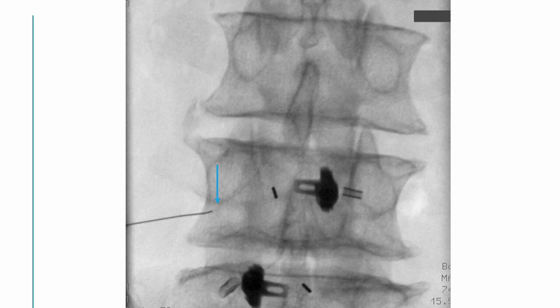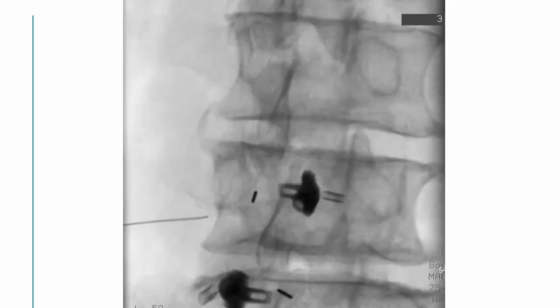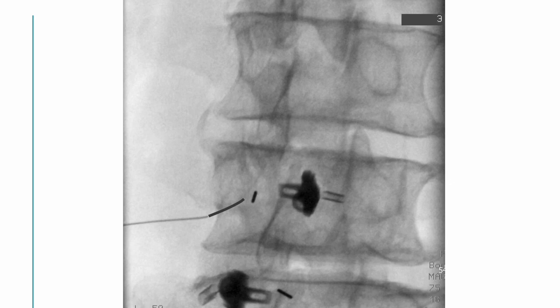Is my needle correctly placed? According to the control lateral oblique view, it is not enough.